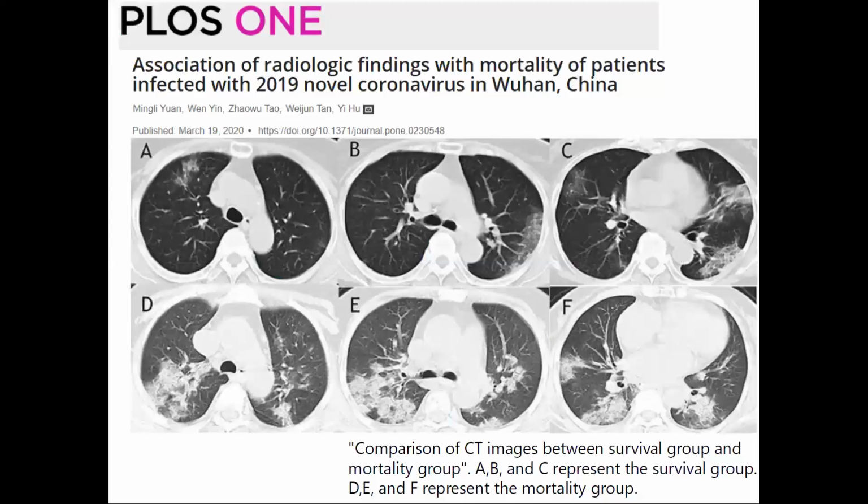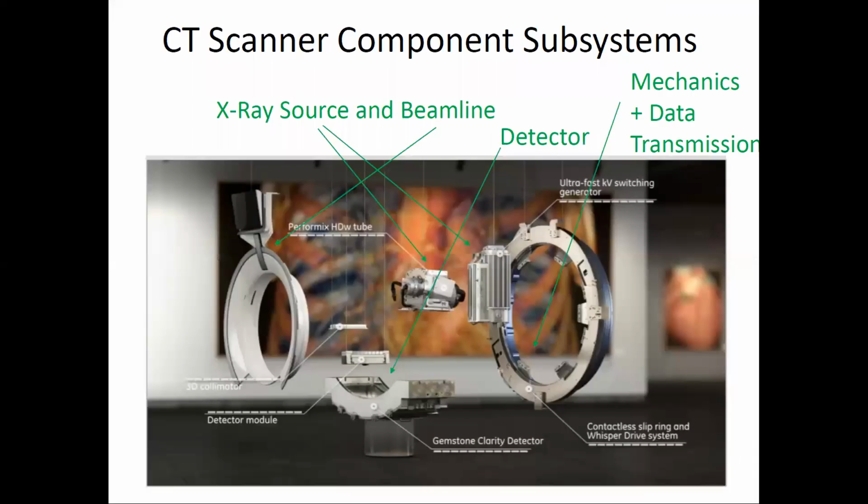And that history goes on now to include our current situation where CT is a mainstay for COVID-19 treatments and diagnostic imaging. But I can't go into any medical details. I'm a physicist. I'm going to be talking about physics and detector design.